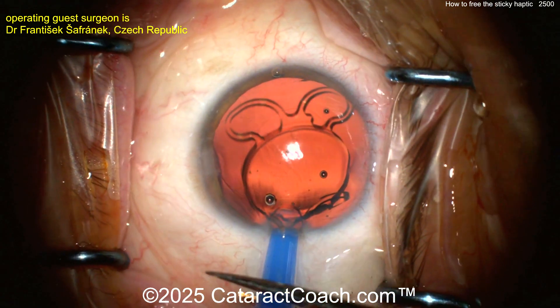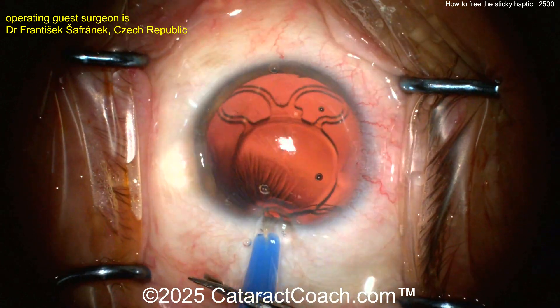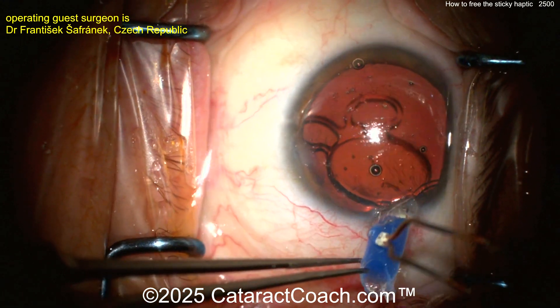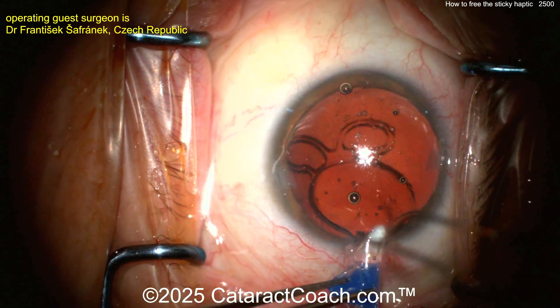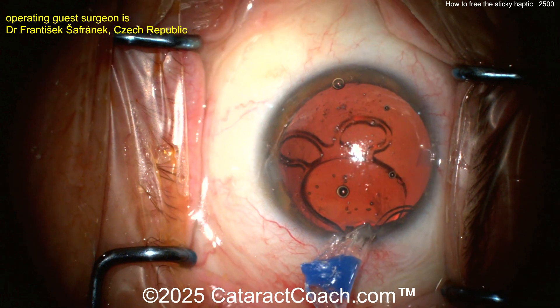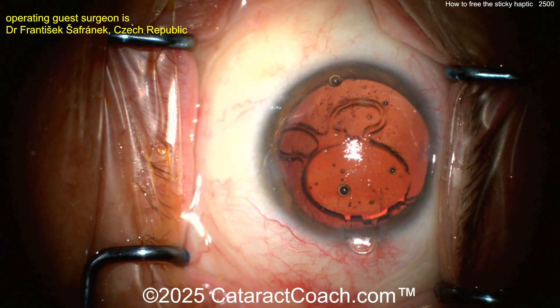Recently there was another case where they tried the same maneuver — cutting again to free up that haptic — but it didn't work. So now what? He's going to use cautery and just melt that plastic open without damaging the haptic. When you open up that cartridge you can actually free up the haptic. I love the innovative thinking. This is not a lens we use here in the USA so I don't have experience with it, but if you're getting that many misloads I'd probably switch lenses. Once he's opened up that cartridge it frees the haptic — not damaged at all, it looks beautiful. Now put it back inside the eye.